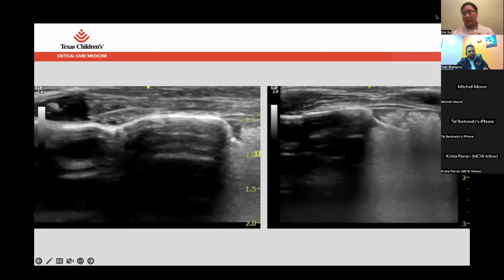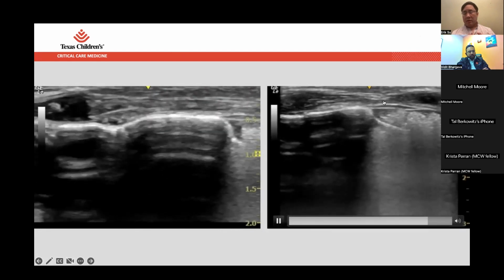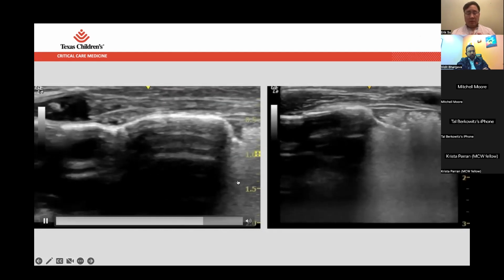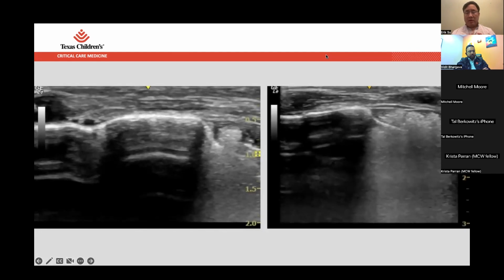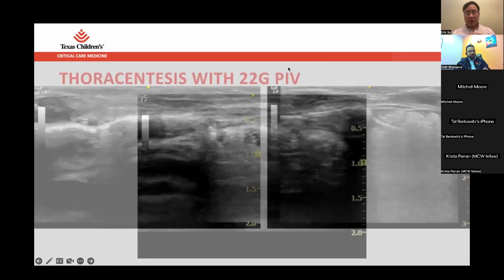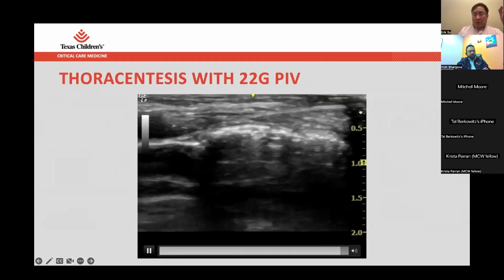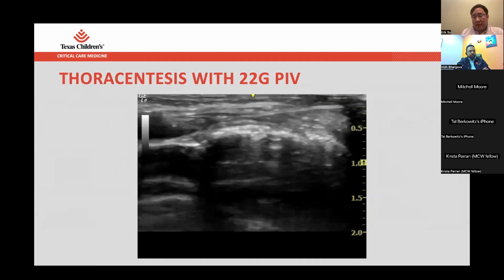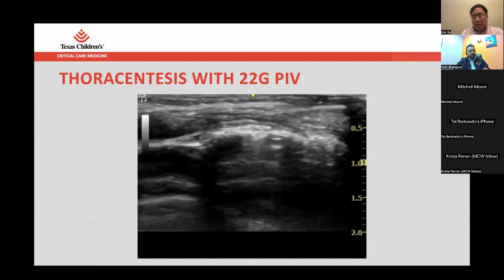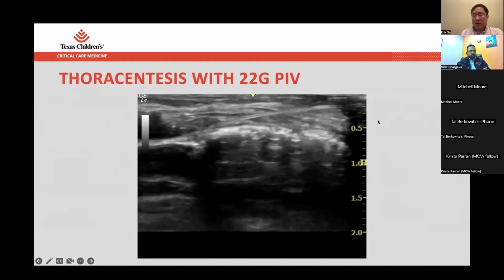So the view on the right is where we're then sliding over to target, dropping the needle in right at the edge of the pneumo. What we prefer to do with dynamic insertion, instead of doing it short axis, is to do it long axis, and we did it with a peripheral. We had the really long vascular access team IVs, like 1 3/4 inch long 22 gauge peripherals. This is not going to be easy with a 1-inch 22 gauge.